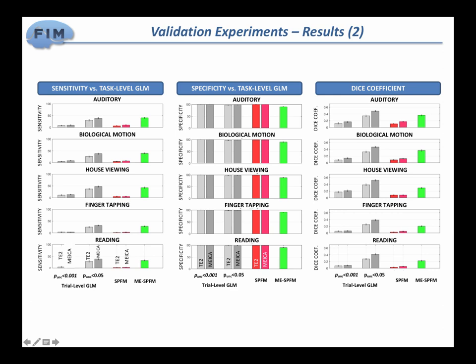And again, keep in mind that to get this, I had to use the information about when things were happening. To do this, I just go completely blind into my data. And you can see that that's the case for any of the tasks, for the 5 different tasks. So it's not that you just get that for the motor cortex when you're doing a finger tapping.